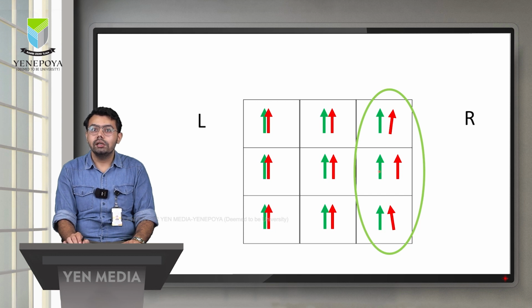As we can see, in case of dextro version, the difference of the image is maximum in that position. In dextro version, the right eye uses its lateral rectus and the left eye its medial rectus. But in this position, we can see the left eye is not affected. So definitely it's the right muscle which is affected. So the answer will be right lateral rectus palsy.